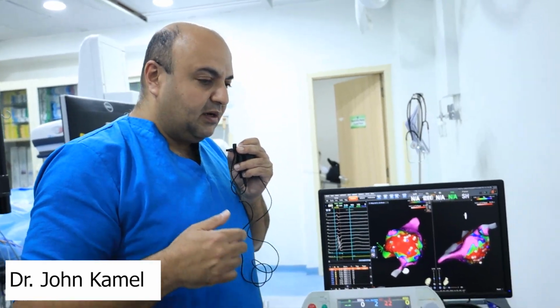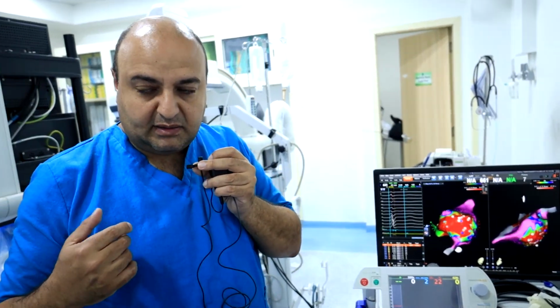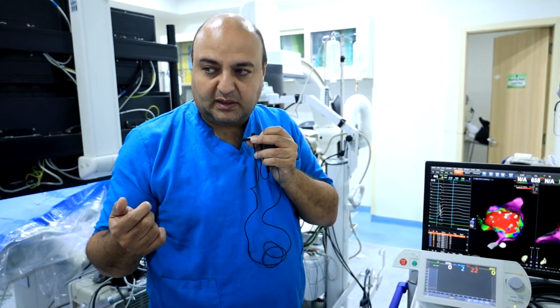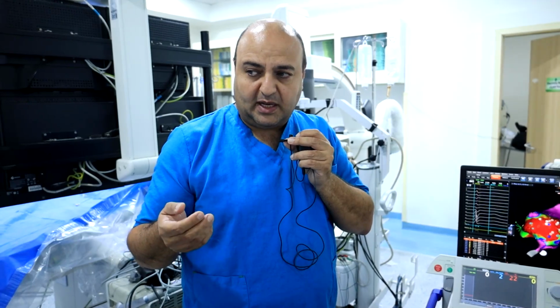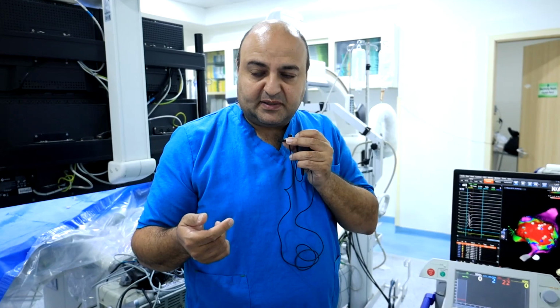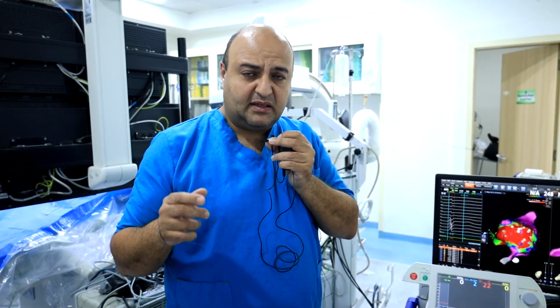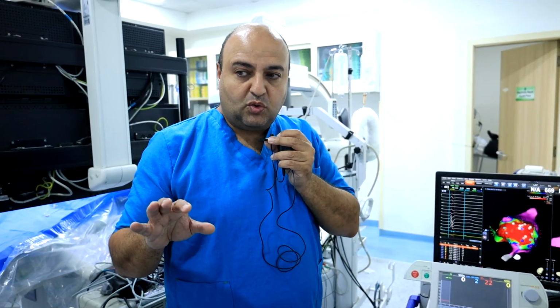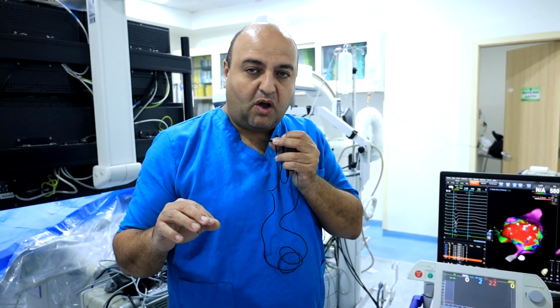Lately, after our work, we tried to induce the tachycardia. We do a post-pacing extra stimulation protocol up to triple extra stimulation from RV and LV to see if there is inducible tachycardia or not. And thank God, there is no inducible tachycardia at all. So we ended the procedure and it's identified as success of ablation.